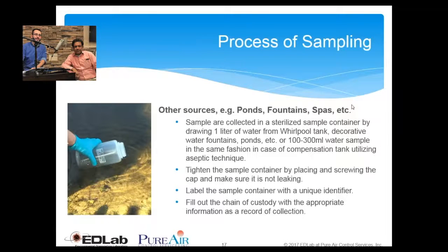Dr. Sahai, are there any other sources you could go over when it comes to water sample collecting? Exactly. The Legionella sample is not just meant for the water system run in the building. Rather, it can also be collected from in and around the building. Many times, big buildings have fountains and a spa, etc., and the pond around them. So, if it is a pond which is decorative, for making the value of real estate up and stuff, you should also be concerned, especially when you have a Legionella episode. So the pond water can also be collected.